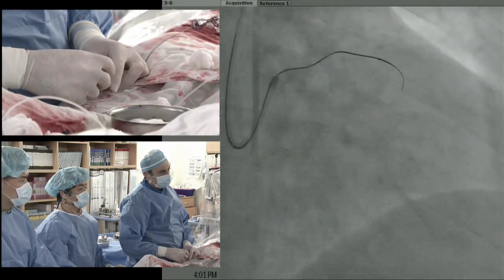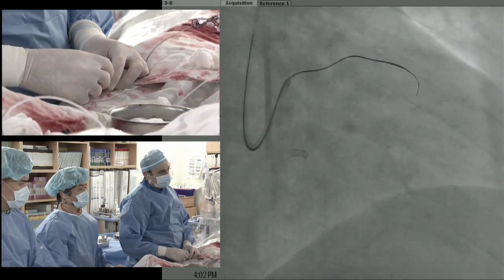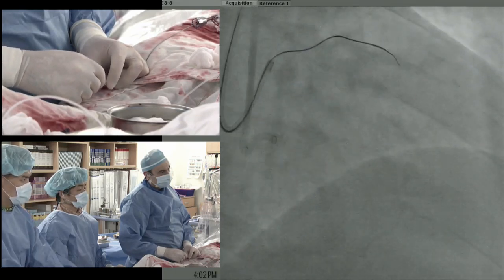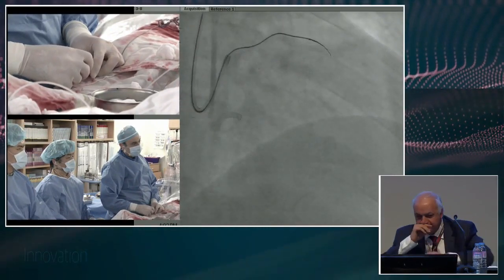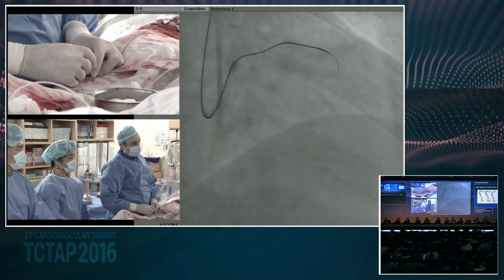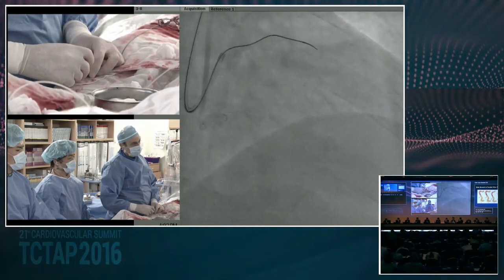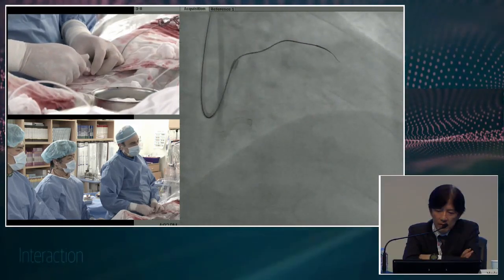Can we make one wire in the septal and make a parallel wire in the main branch? As a parallel wire technique, because every time it goes to the septal, so I think it's an anchor wire technique. We could. Sometimes the wire directly connects from the subintimal space to the septal.